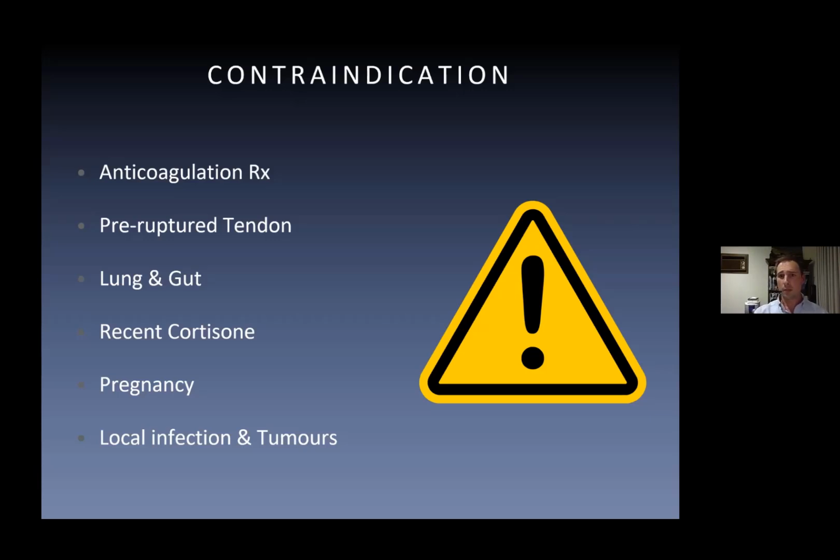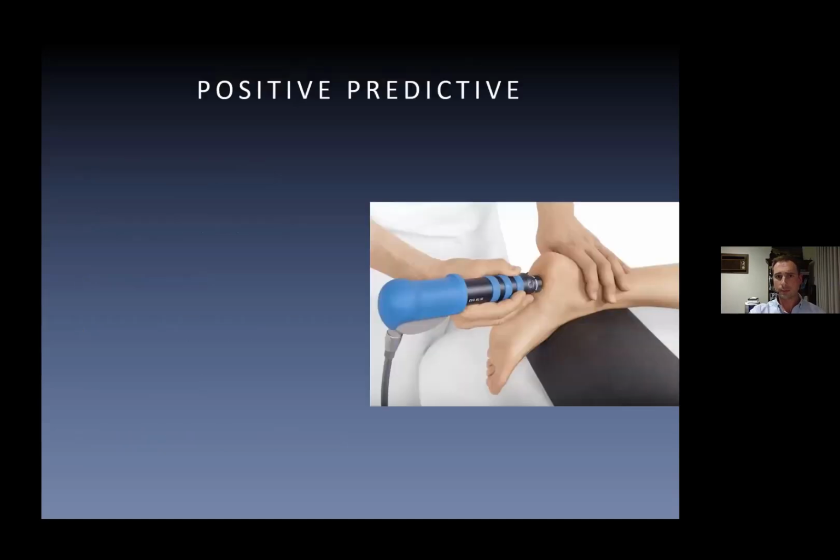Pregnancy, like most things, hasn't been studied with shockwave. So although there is no study showing harm, there's also no study showing that it's safe. So we err on the side of caution. Local infection and tumours is quite self-explanatory.